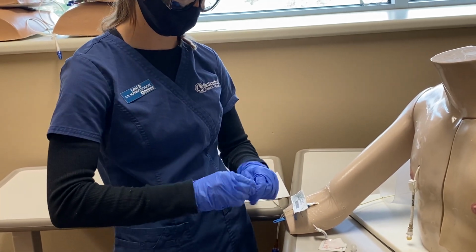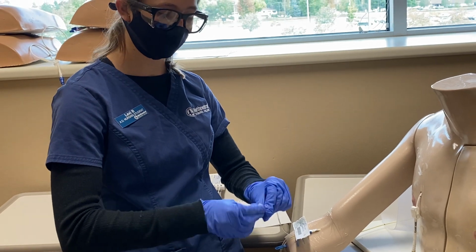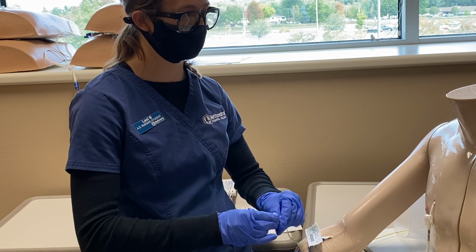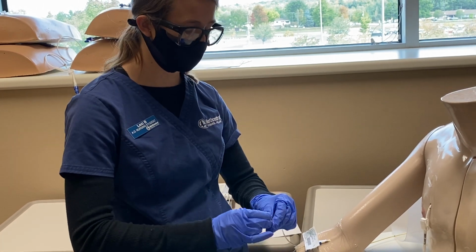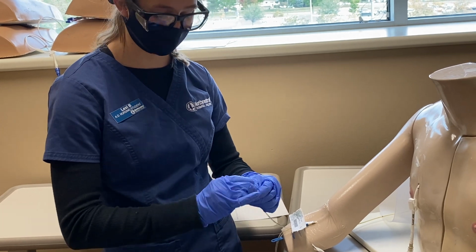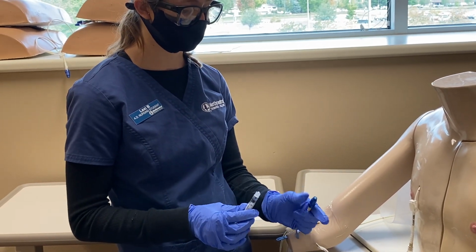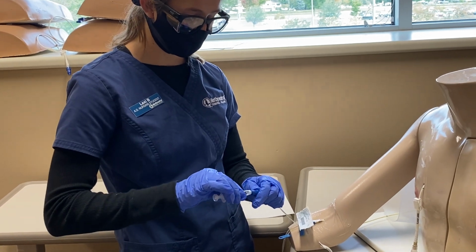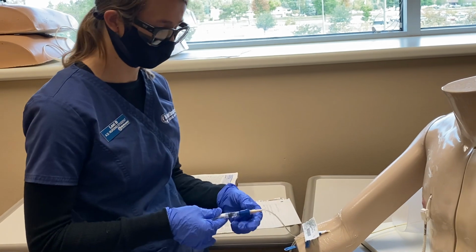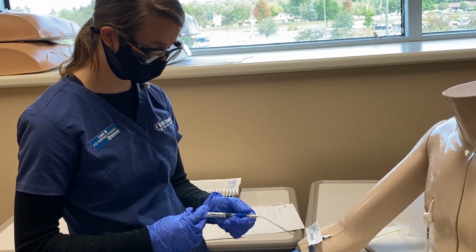And I'm going to cleanse again for 15 to 30 seconds. This time I will be administering the medication. So like we talked about, those adverse reactions, that hypotension, any respiratory depression, please let me know if you feel any of that. The rate of this is to be administered over 1 milliliter every 2 to 3 minutes. So that is how I'll be administering it today. Watching the time.